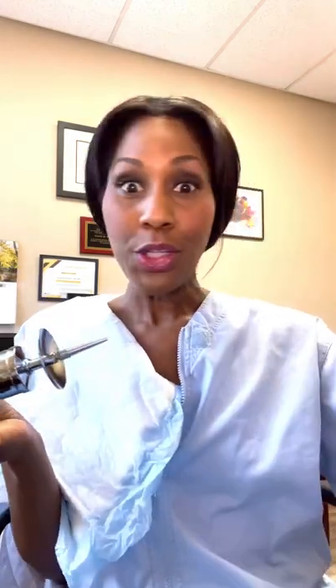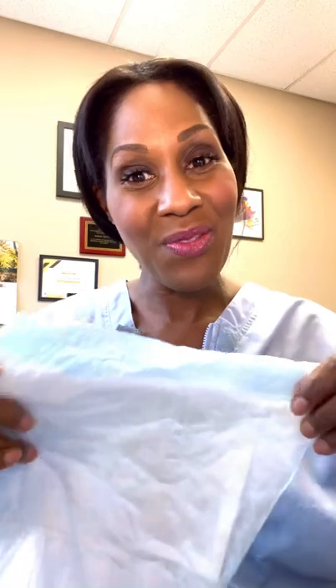So guys, along with my diaper, these are a few ways to clean ears. Remember the patient holds the container while the doctor squirts the water in the ear and it comes out with the wax — we'll do that a number of times. Your doctor may also have the newer sprayer gadget as well. Check out my other videos on earwax — how we remove it, how it's safe to remove, how you should remove it. Remember to consult your doctor for everything — super important. I'm Dr. Jen Cottle, a practicing family physician and on-air health expert and video creator. I do daily videos, so please like and follow my page. For those of you who send stars, I respond personally, and consider joining my group for special perks called Dr. Jen Superstars.